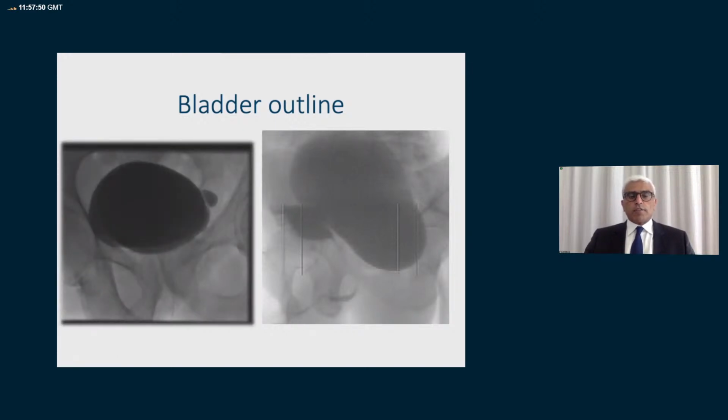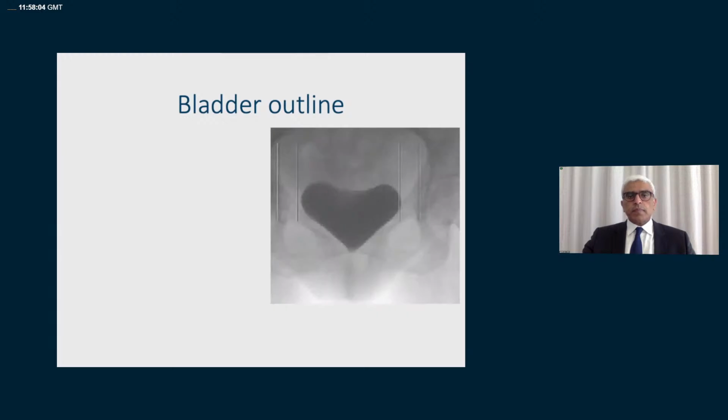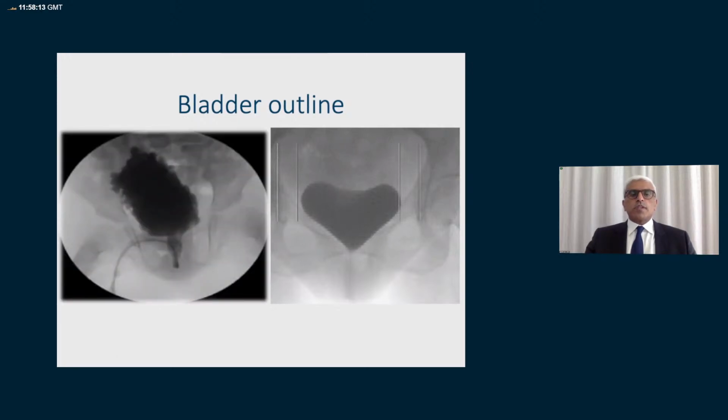This can be as a part of an outflow obstruction or can be congenital, but this is a morphological picture or an anatomical picture of what the bladder is like, and that can be the only cause of having infections. If there's any indentation from other organs, that can also be picked up as the bladder is filled up. And of course, this is a classic neurogenic bladder with a fir-tree appearance with the dilated prostatic urethra.